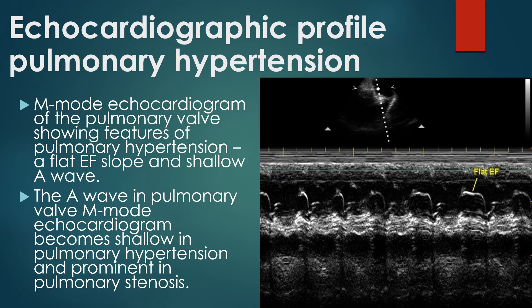M-mode echocardiogram of the pulmonary valve shows features of pulmonary hypertension: a flat EF slope and a shallow A wave. The A wave becomes shallow in pulmonary hypertension and prominent in pulmonary stenosis. M-mode assessment of the pulmonary valve was routine before Doppler echocardiography was available, but now it is seldom used, as right ventricle systolic pressures can be measured much more accurately from the tricuspid regurgitation jet by Doppler echocardiography using the Bernoulli equation.